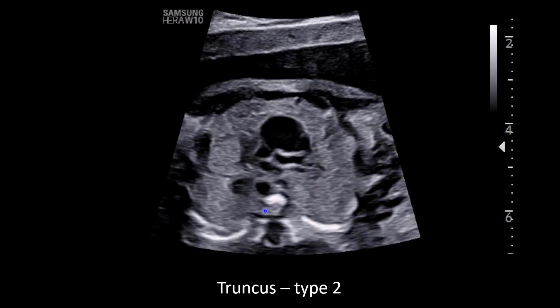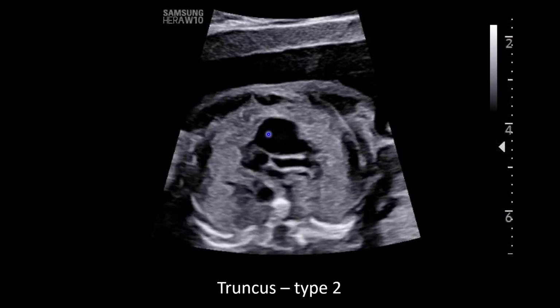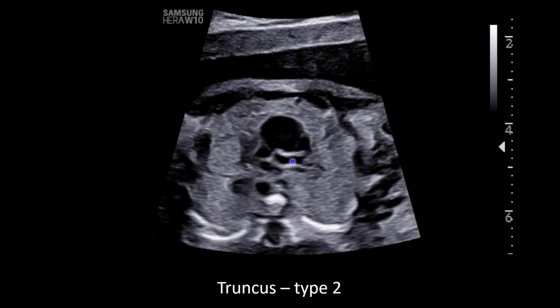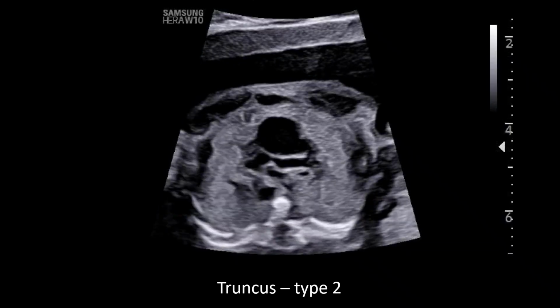A little better look at that, and you're going to see sort of ascending here. This is a left-sided aorta, but just look how dilated that ascending aorta is here next to the SVC. There's the trachea right here at the end. Trachea right there. Okay.